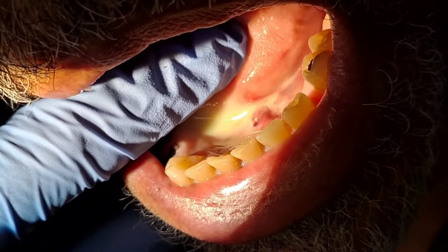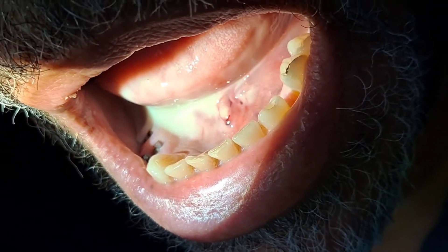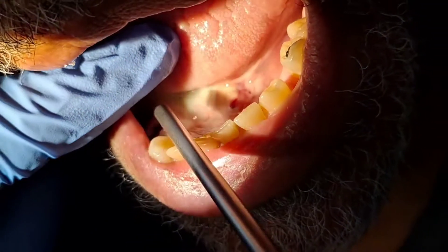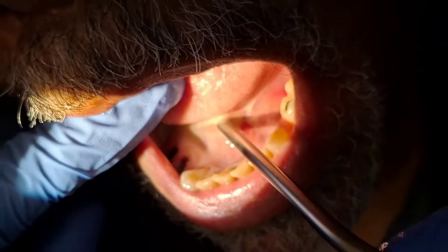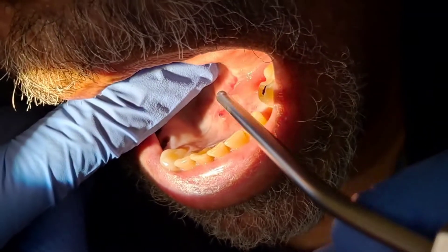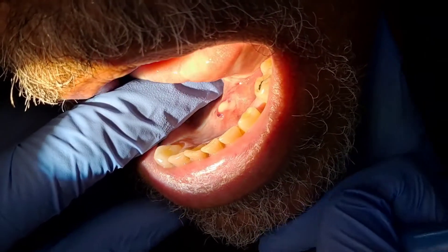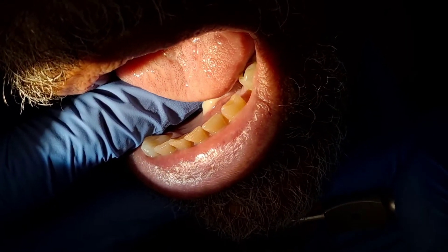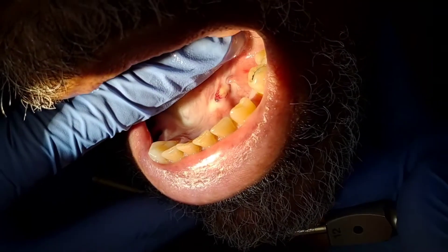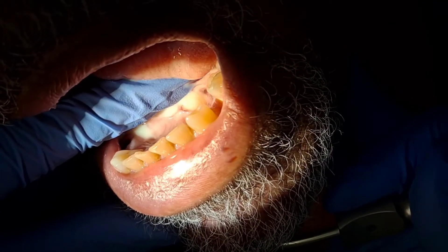This patient didn't have much pain from this infection. The duct was left open and not sutured. The patient needs follow-up to make sure it doesn't develop a stricture of the sub-mandibular duct. The patient was sent home with antibiotics and sialogogues in order to stimulate salivary flow.